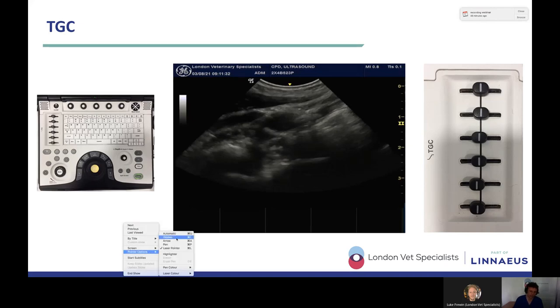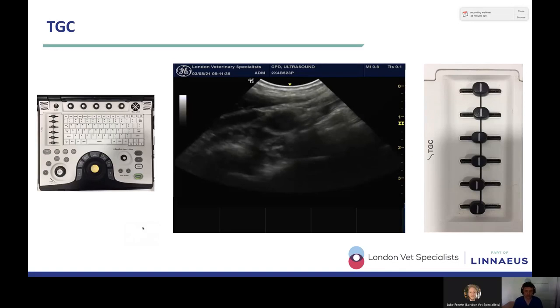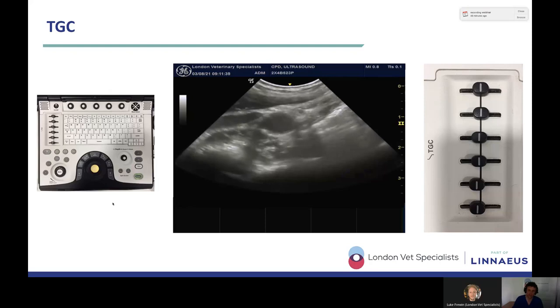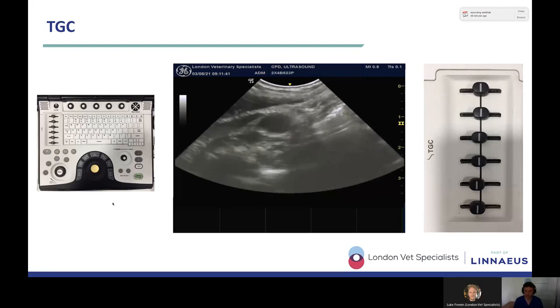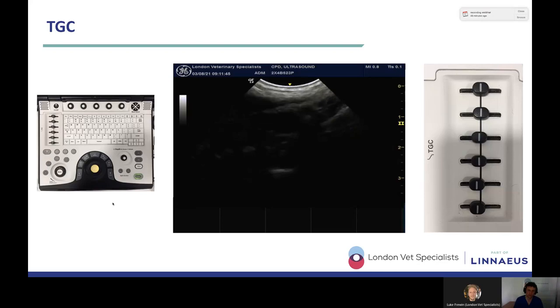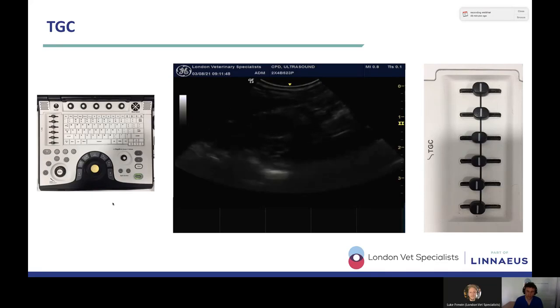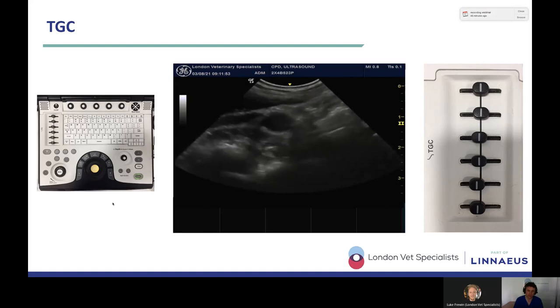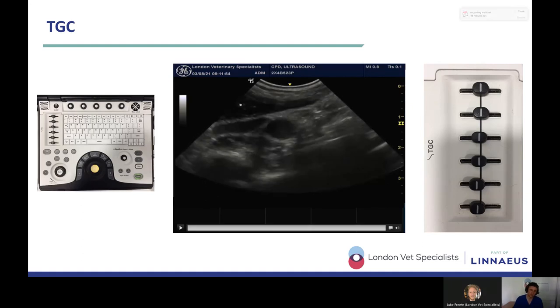So let's see what happens when we have a little play around with the sliders of our time gain compensation. This is me just pushing the sliders from top to bottom, from left to right. So increasing them all in turn from top to bottom, and then decreasing them from top to bottom. You can see that we don't get an overall change in the gain. We get different points at different depths getting brighter or darker depending on which slider we're adjusting.